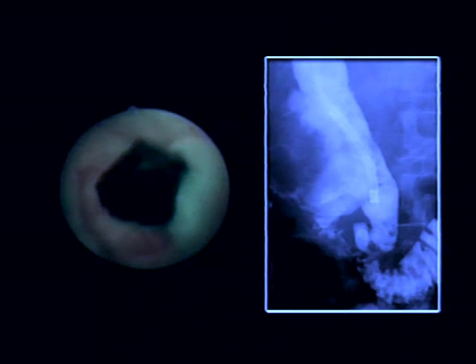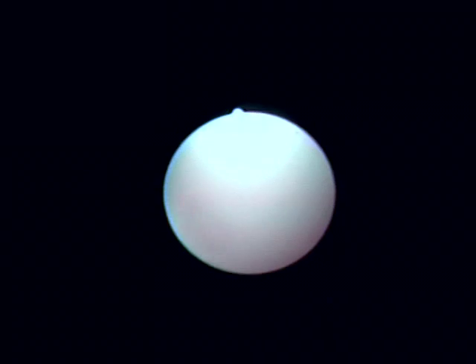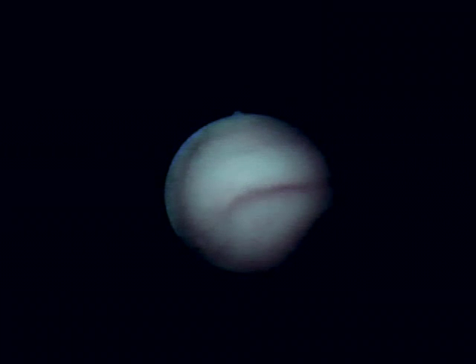Cholangioscopic pushing method comprises 2 components. The first step is engagement of small stones into the far distal CBD, and the second step is pushing the stones into the duodenum by exerting mechanical force with the cholangioscope.